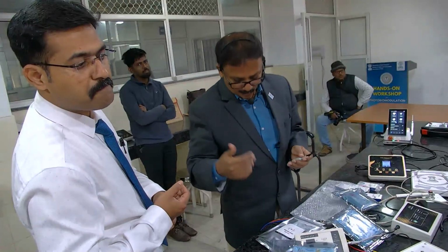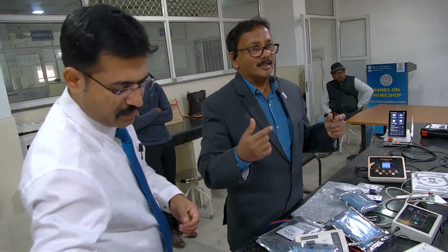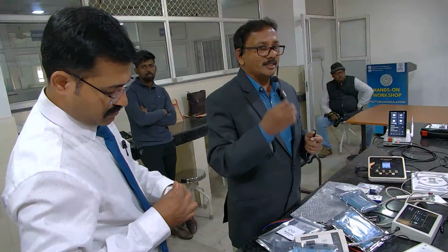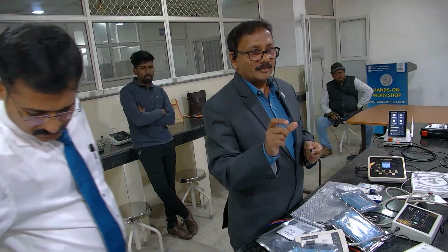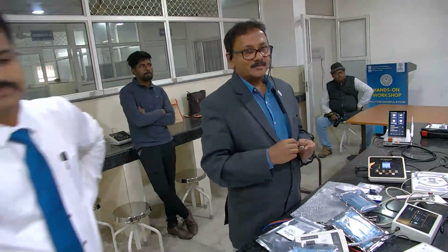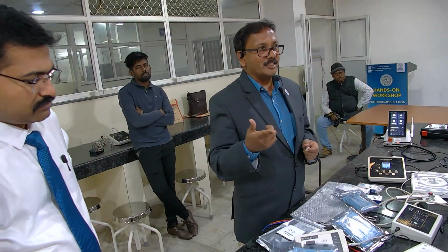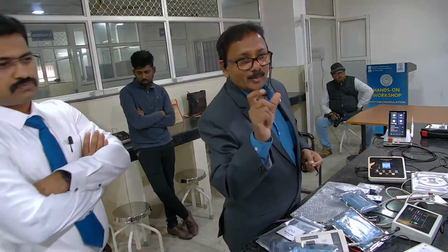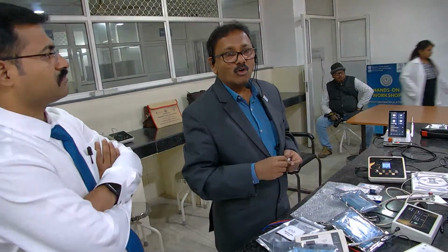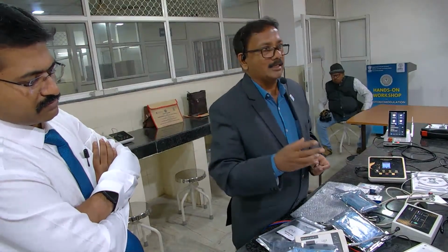The advantages of doing laser therapy in root canals: the studies, PubMed articles, say that with sodium hypochlorite irrigation, the accessory canals it can reach are 50 to 100 microns deep. If you do it through laser, studies have shown, and I will quote them if you make a WhatsApp group, it goes up to 1000 microns into accessory canals. So all your pathogenic bacteria, including E. faecalis, the most resistant organism in the endodontic canal, will have an instant kill.